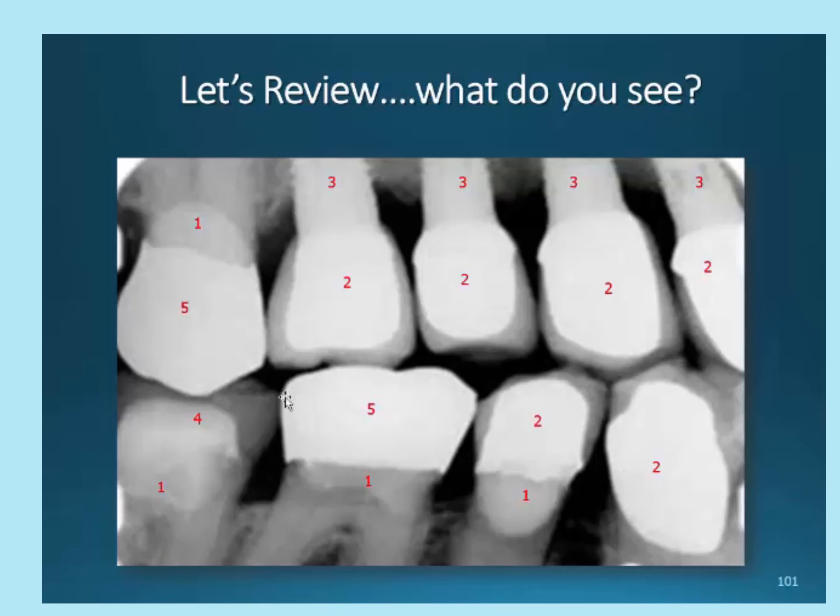3 are implant structures. Can you see the posts all the way across? 4 appears to be a crown made out of composite. This whole area, definitely not any porcelain going on, even though there is a base. 5 is a full coverage crown. And these are all porcelain fused to metal, as mentioned earlier. So let's take a moment. You may want to study this slide later on and come back to it. There's a lot of dental restoration in this slide.